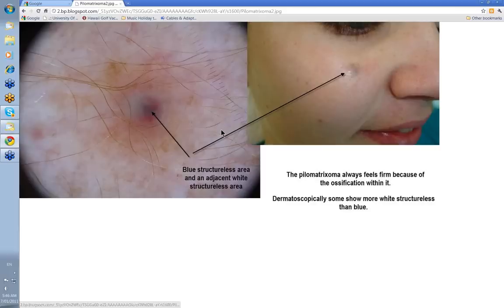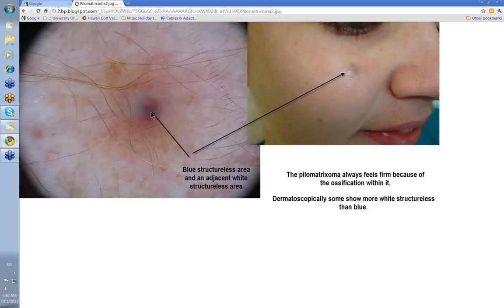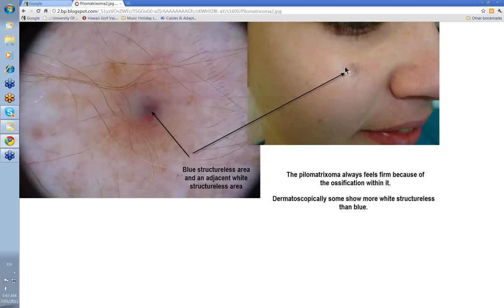Let's look at another one that's a mixture of two features. This is a young lady with another cyst-like lesion on the face. She had been traumatizing this a little bit, so there was a little bit of blueness from haemorrhage within the area. But again there's also a white area here, due to calcification within the cyst. So here we've got a mixture of blue structureless and white structureless in a pilomatrixoma. This is the sort of age group where you'd expect to see it — a younger person on the cheek.